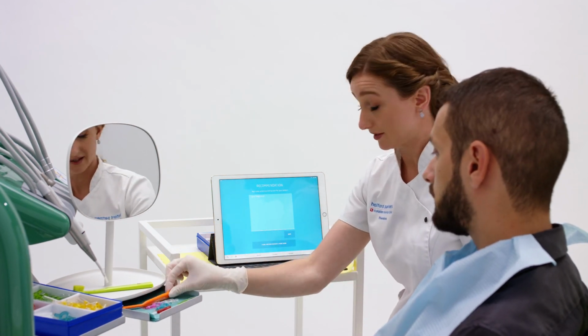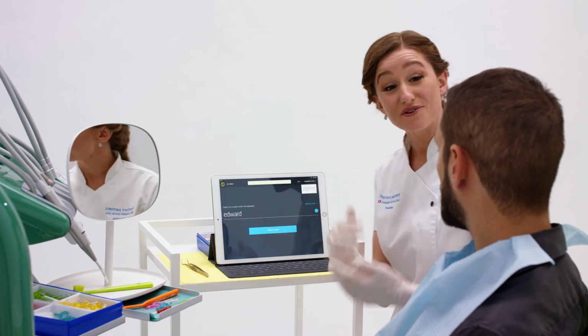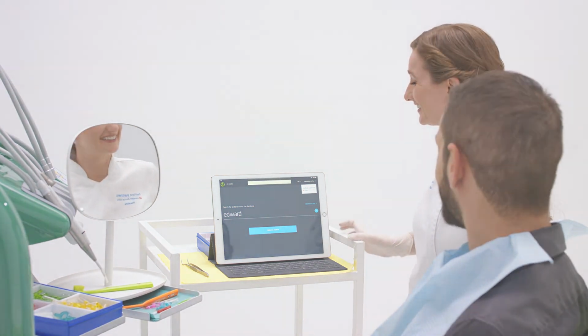I then save, close this Bob session and send the patient his Bob score, which he will receive via email. That now completes the Bob Silent method.